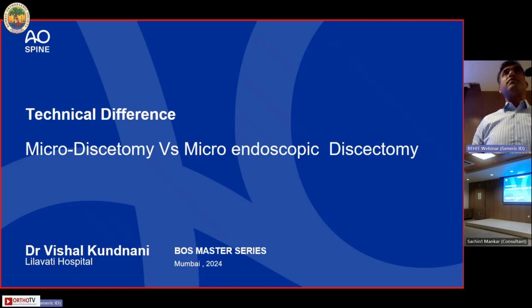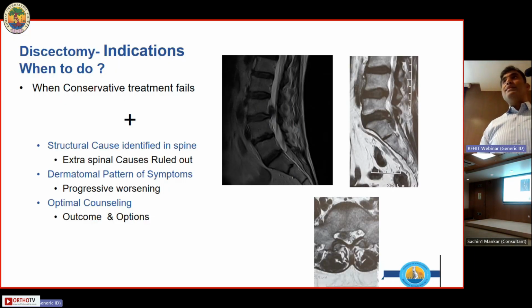The definitive part of the surgery, which entails removing the offending disc fragment, remains the same. However, whichever technology, whichever technique you use, the definitive surgery just does not change, because if that changes, the outcome will surely change.